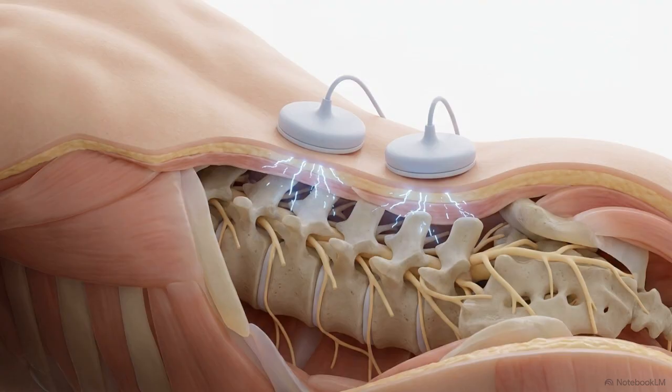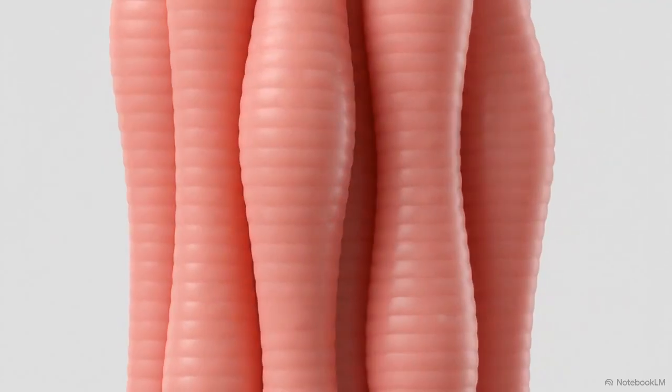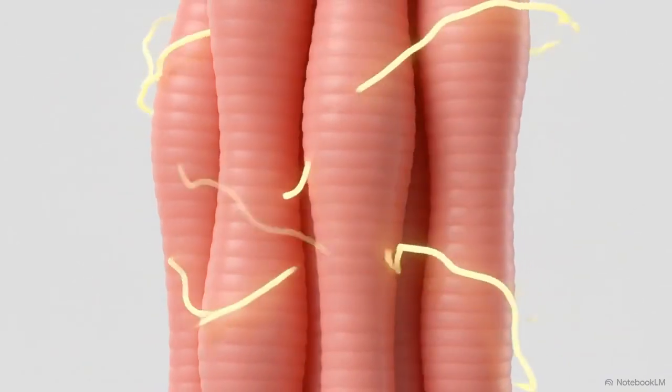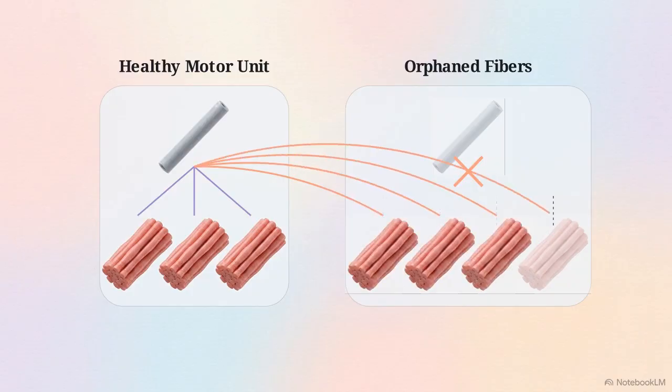Nerve conduction studies have a major limitation. Surface stimulation cannot reliably assess conduction blocks across deep proximal plexuses or spinal roots. To diagnose a radiculopathy, we rely on needle EMG. Instead of stimulating the nerve directly, EMG observes how individual muscle fibers react when they lose their nerve supply. The electrical signature of the muscle reveals the timeline of the injury. Acute denervation triggers spontaneous, erratic firing, known as fibrillations. Chronic damage alters the physical shape of the motor unit action potentials, as surviving neighboring nerves sprout new branches to reinnervate the orphaned muscle fibers.